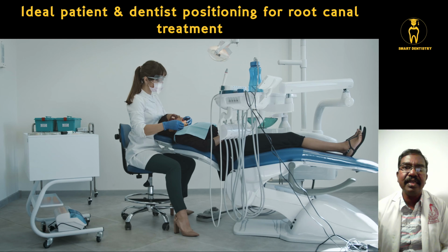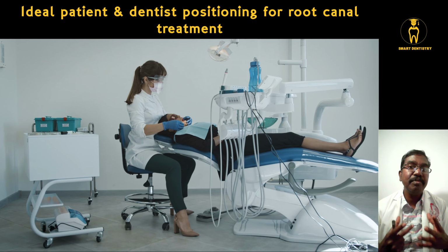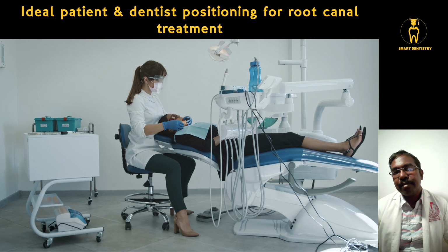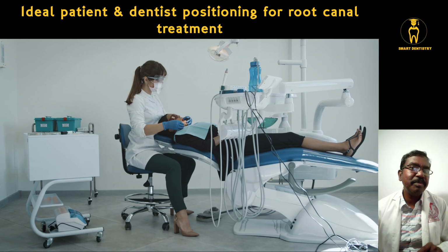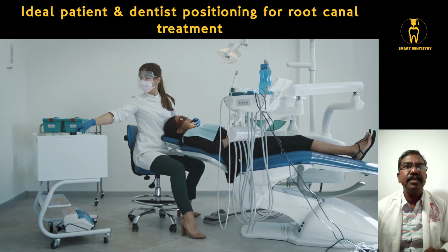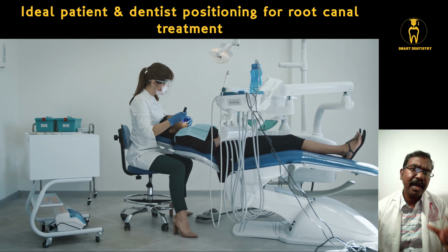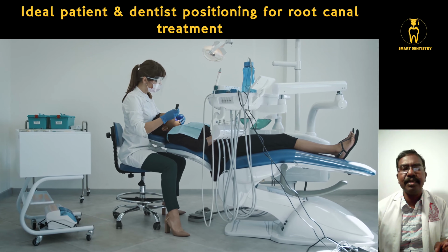And the second advantage is there will be less strain for the dentist, and the third advantage is there will be a maximum mouth opening for the patient, and also it will be more comfortable for the patient in a lying down or flat position. So from now onwards, if we make the patient lie down flat in the dental chair, that will be the first step for the beginning of success in doing root canal treatment. It is easy to follow, and at the same time a highly effective tip.